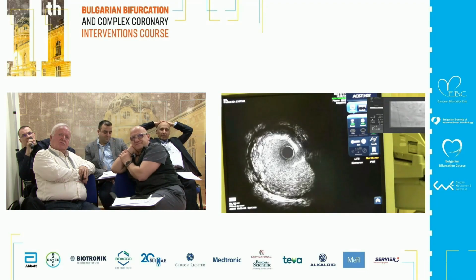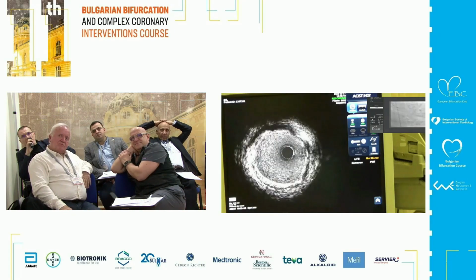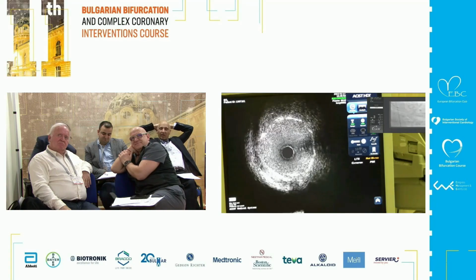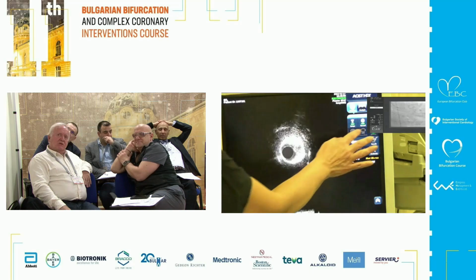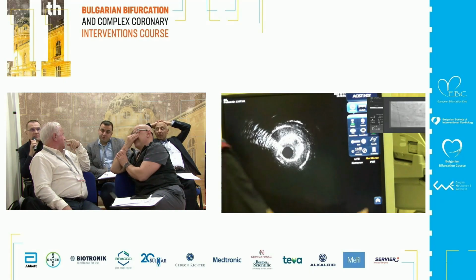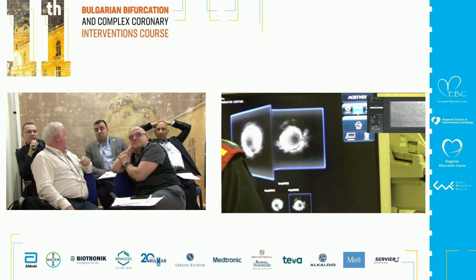But it looks fine. And I think this is more than 3 to 5. It's around 7, 8, I think. Just on visual. Okay. Yes, they would. Eva, let's measure it.